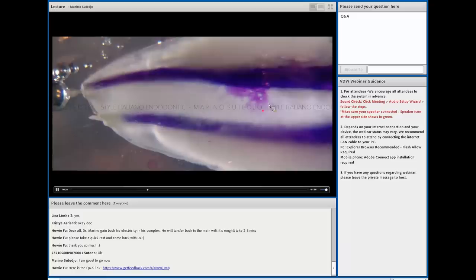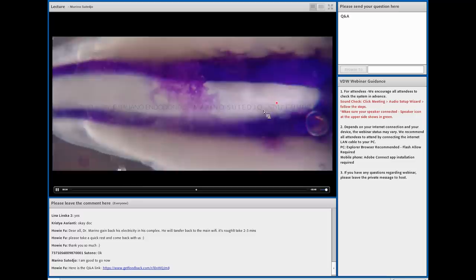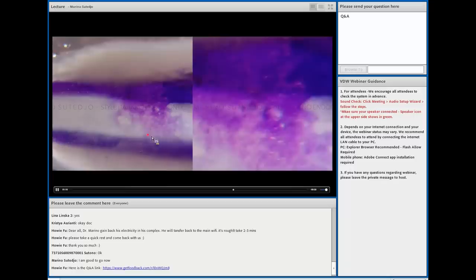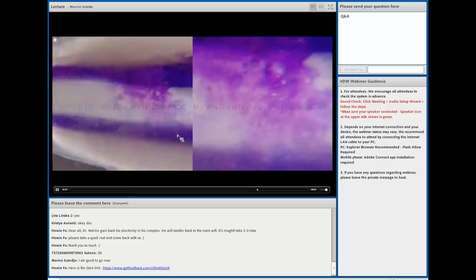So this is something that we need to be aware is happening in our systems, because a root canal is not just a canal, it is a system. And if you just put it like this, and you don't apply any activations, there is no lateral pressure compared to if you put it into this area. But if you put it in both this and this area, as you can see, now I'm putting my ultrasonic in this area. Now on this side, it tries to press laterally and clean the isthmuses better. You can see it. Now it continues to have a continuous connection between one canal and the other canals. So this is a system that we definitely need to pay attention to when cleaning. Our shaping cannot clean this area. What our shaping can do is create this volume so our irrigants can go in to the length, and we can do some activation to drive our irrigants into the areas that cannot be penetrated with just the normal technique of the irrigation protocol.